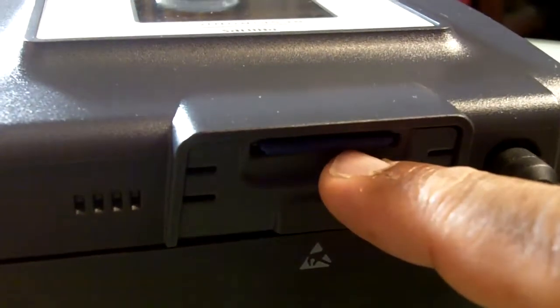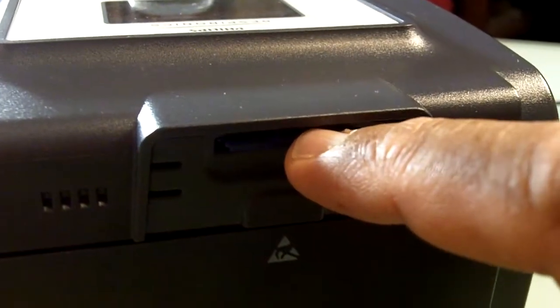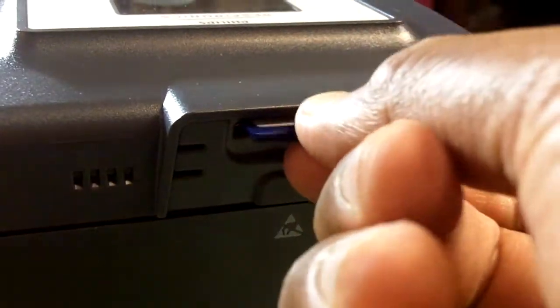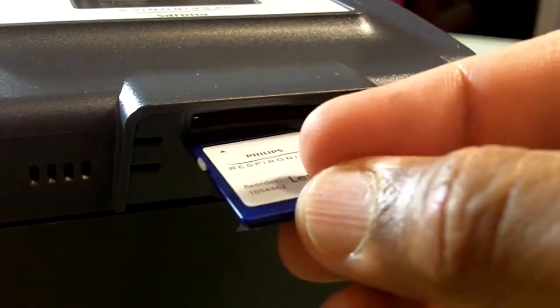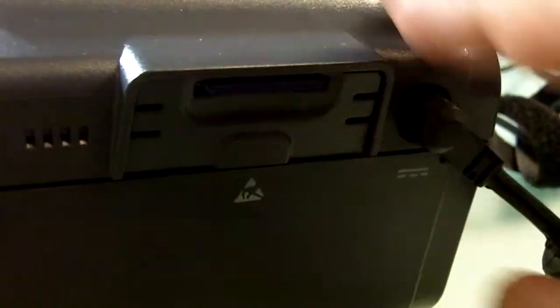In this video, I'm going to show you about the data collection. It uses an SD card. This is the SD card, and it goes right in there.